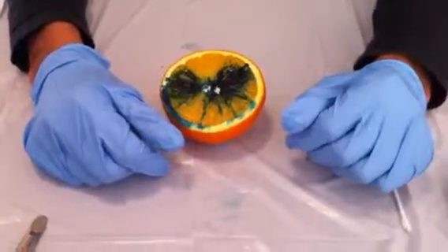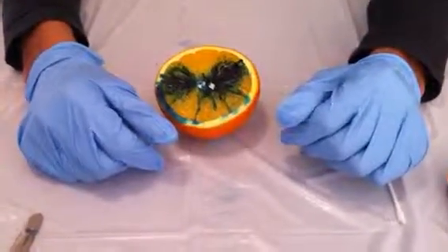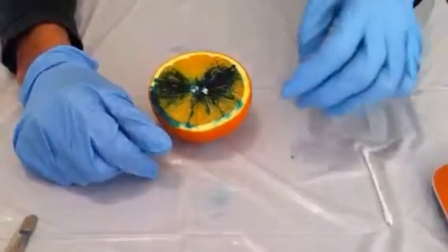Hi, this is the last part of the debridement lab where we are going to do the actual sharp debridement.